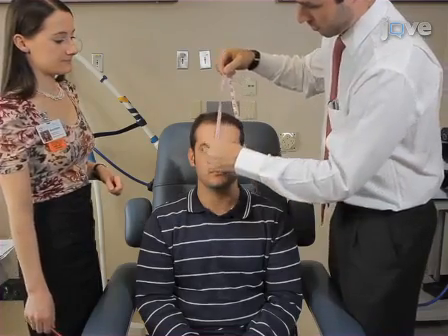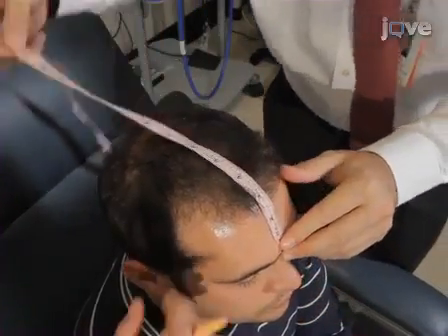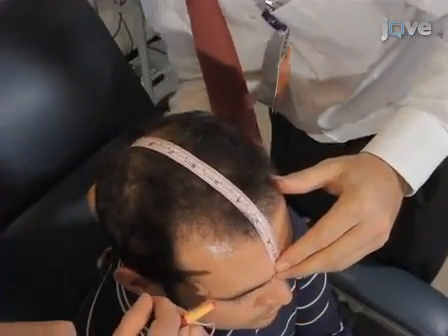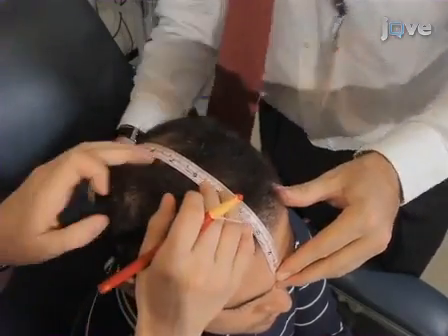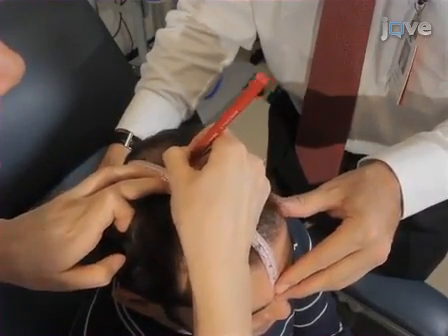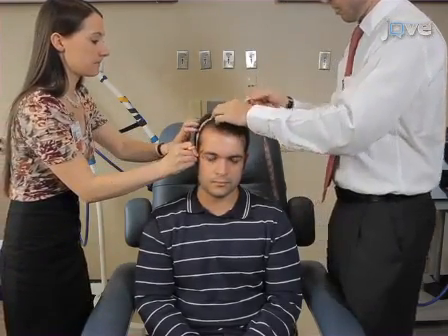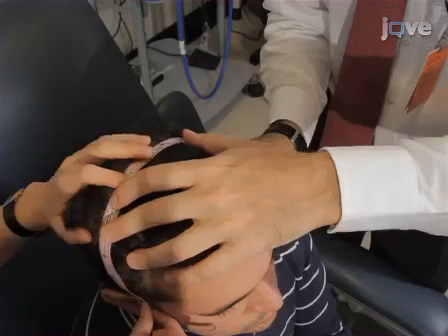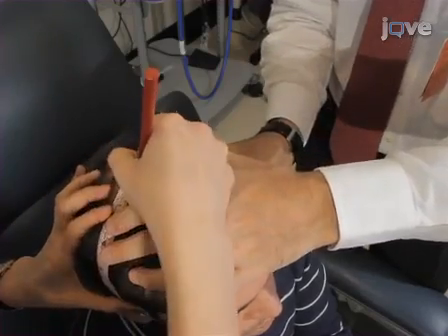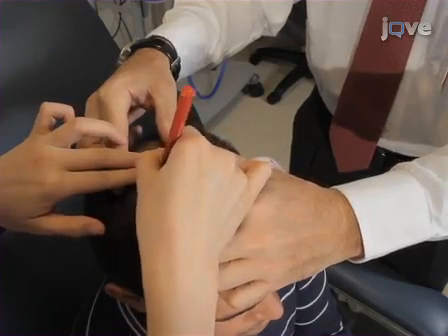To localize the vertex, first measure the distance between the nasion, the point between the forehead and nose at the junction of the nasal bones, and the inion, the most prominent point of the occipital bone. Mark the point halfway between these locations using a skin marker. Next, measure the distance between the pre-auricular points, being sure to place the tape measure over the marked nasion and inion halfway point, and mark the point halfway along this auricular line. The intersection of both marked points is the vertex.